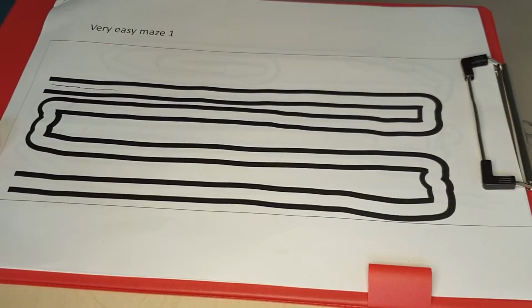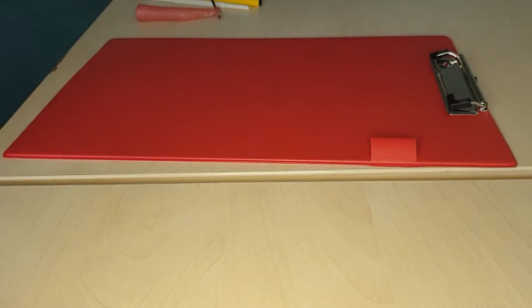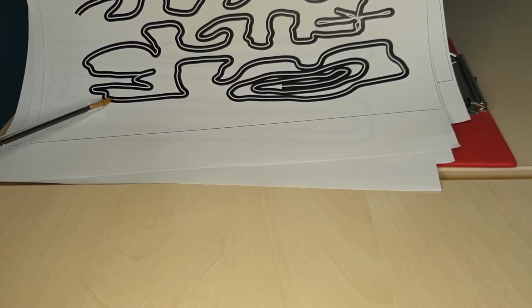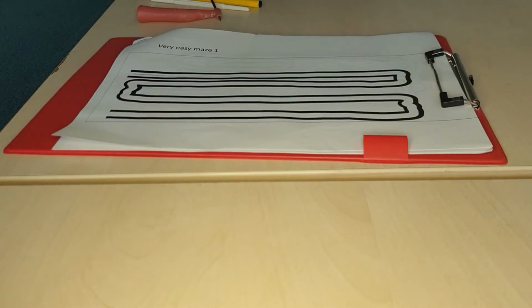This is our very easy maze one, and the mazes increase in difficulty up until a very complex maze, such as this one. What you'll notice about these mazes is not only do the shapes get more difficult, but the margin of error is greatly reduced as we have much narrower tracks for the pen to follow. As we progress through the exercises, we increase the difficulty.